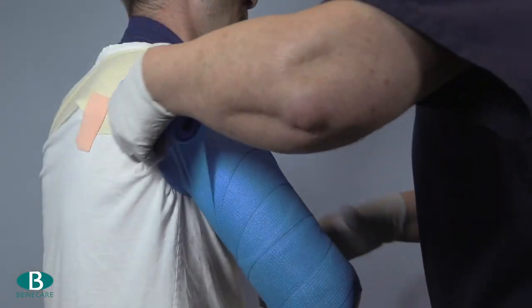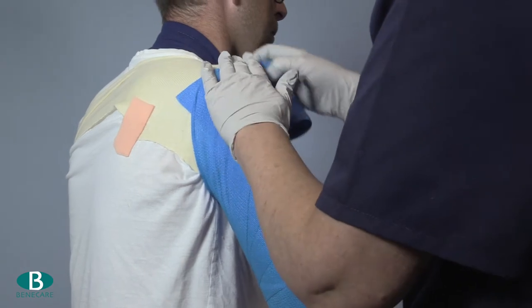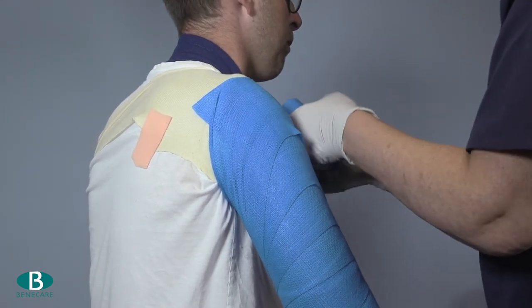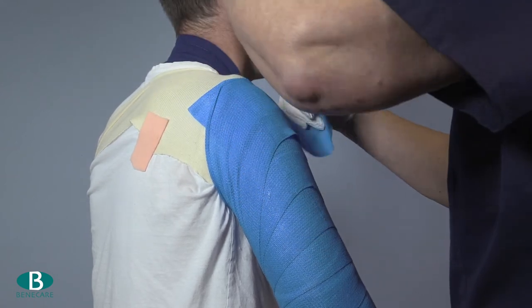To prevent the brace from being bulky in the axilla, lay the casting material across the shoulder by folding back and forth covering 50% as before.